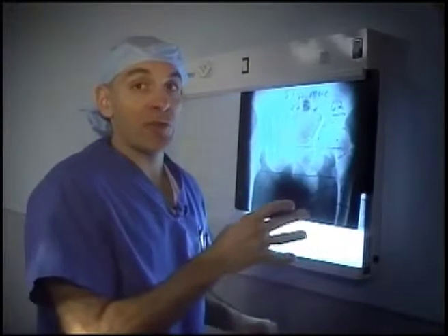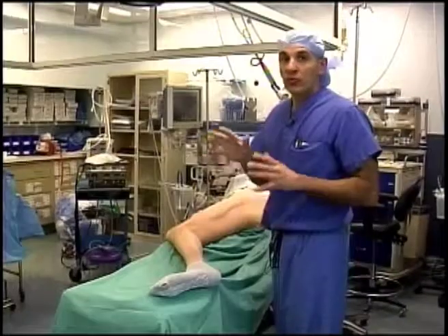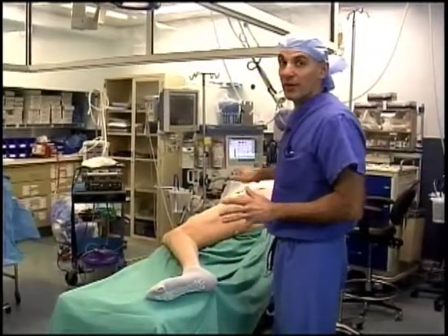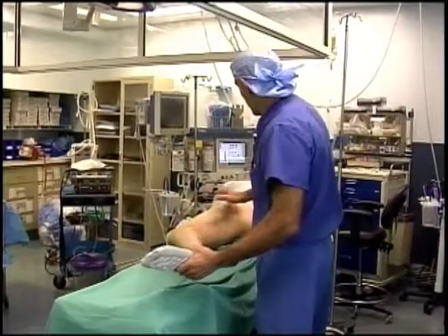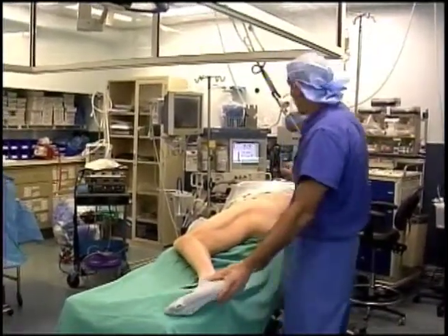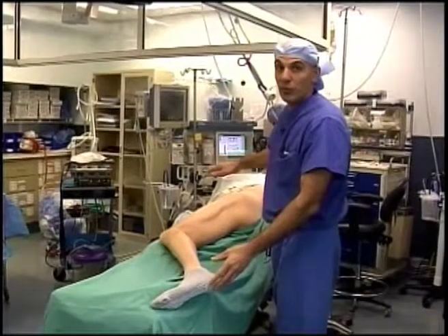While these template numbers aren't absolute, they give us a reference guide to start, which we'll refer back to during the operation. To orient you for what you're about to see: the patient is lying on his right side on the table. This allows the foot to be draped free so we can maneuver the leg during the operation. The patient's hip is positioned in the mid portion of the table, with his head up near the anesthesiologist.